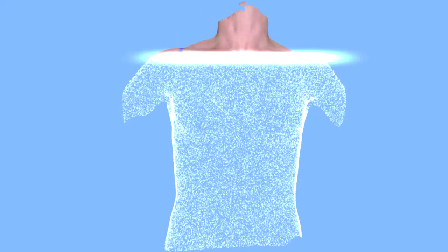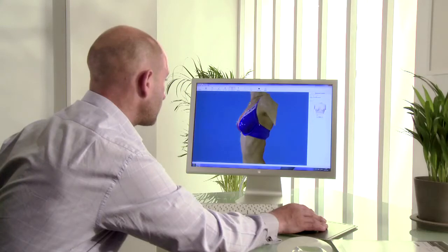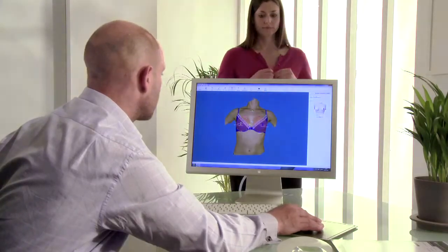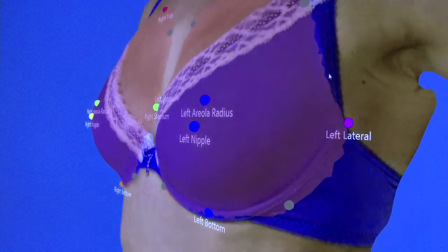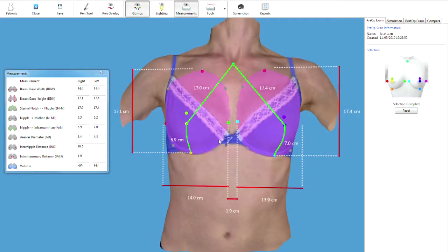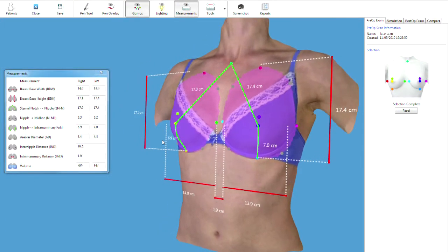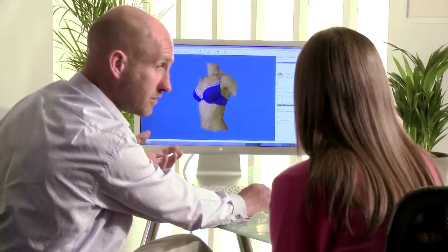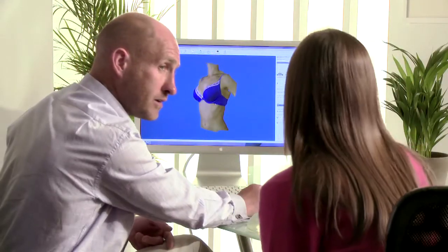In the time it takes your patient to get dressed, you can easily select key landmark points to indicate the breast tissue. The system automatically generates industry standard measurements such as base height and width. Volumetric measurements are also calculated to enable analysis and discussion of symmetry.